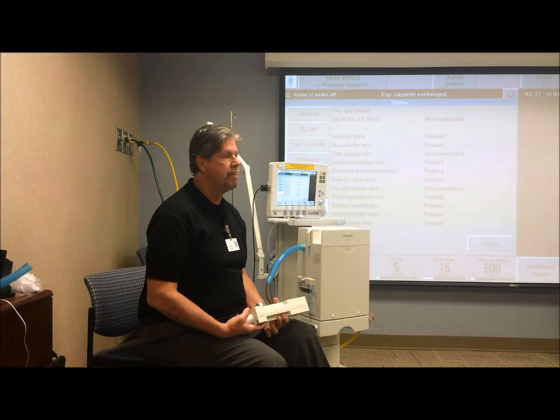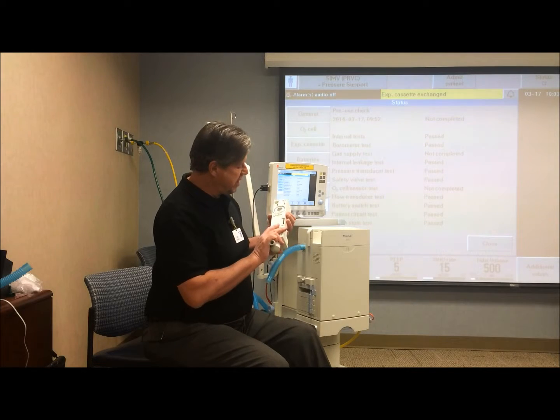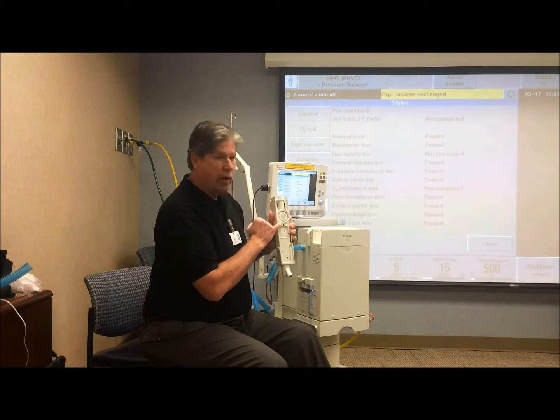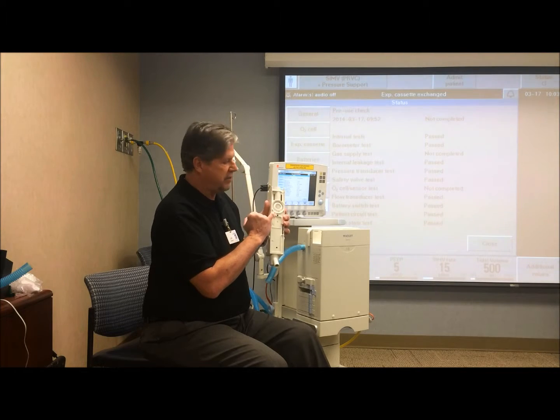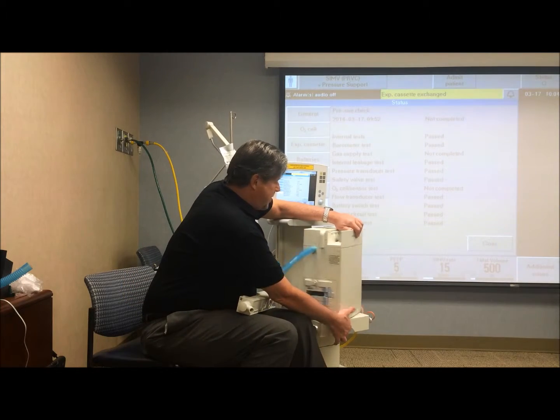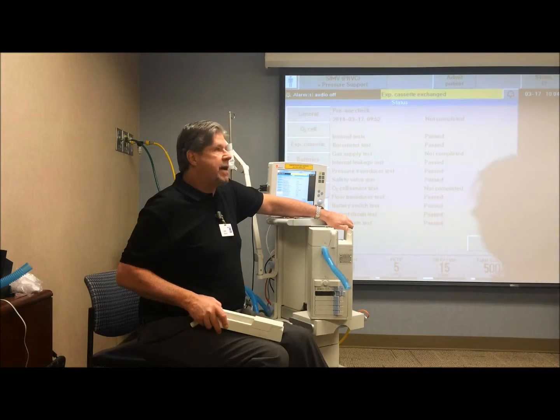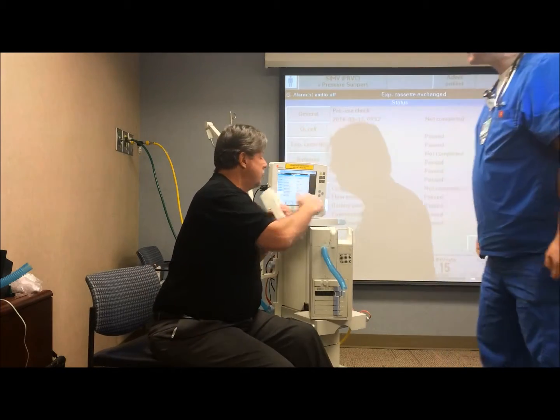We did also have a few times when maybe the cassettes weren't dried thoroughly during the cleaning process, and you'd get a flow transducer test failed. Particularly with the older style cassettes, which you might still have, this port right here is much smaller, the orifice is much smaller. That port mates with this grommet in here.